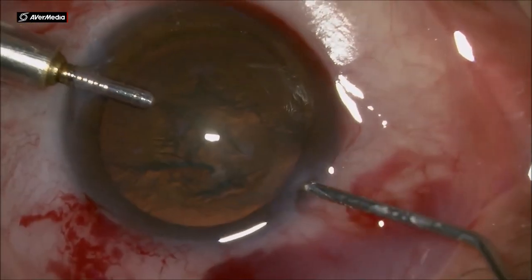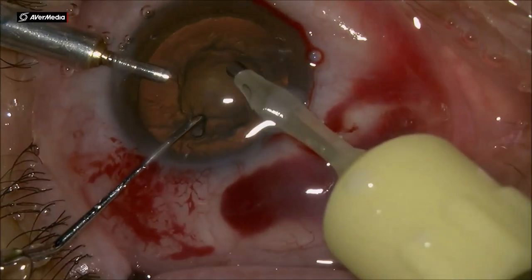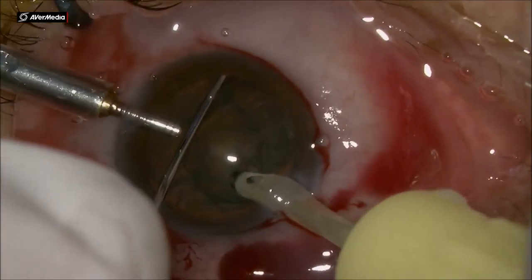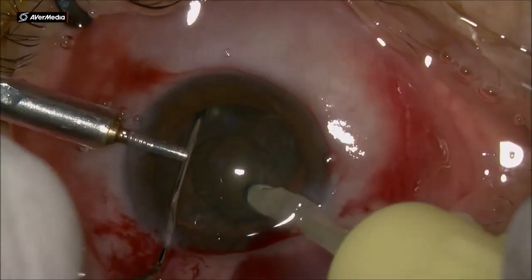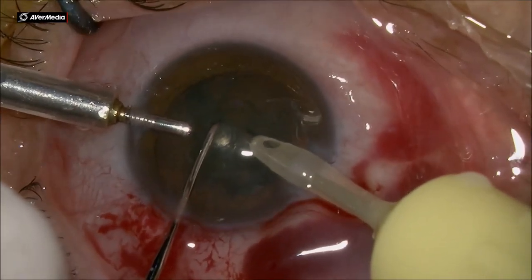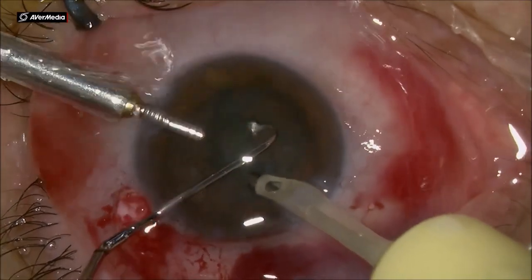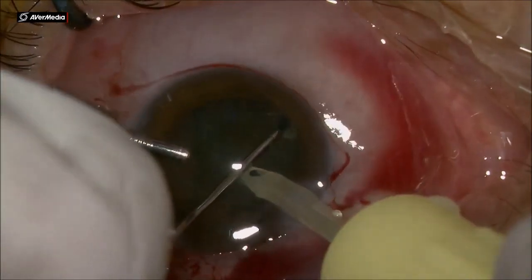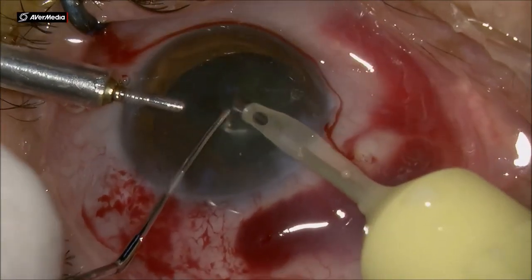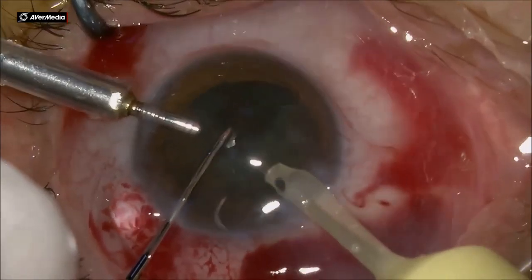Having the main paracentesis, placing the viscoelastic inside the anterior chamber, and using a long chopper. The irrigation from the AC main tunnel is closed. Using the long chopper, I'm doing a horizontal chop. The cataract is pretty soft, but I'm able to go all the way to the posterior plate and have two heminuclei.